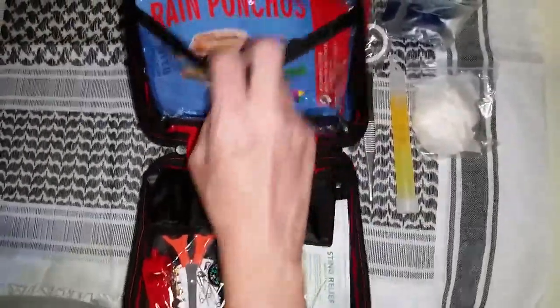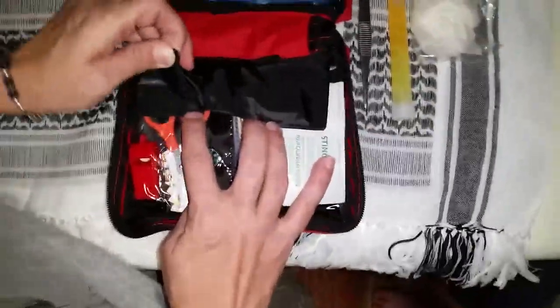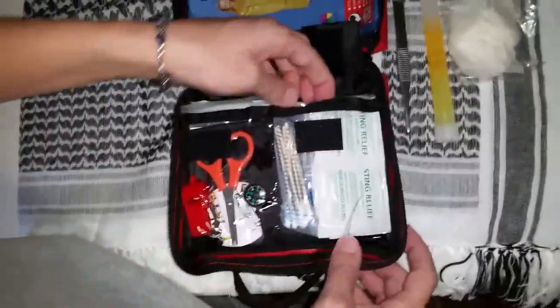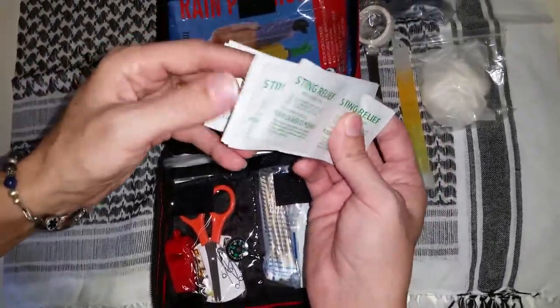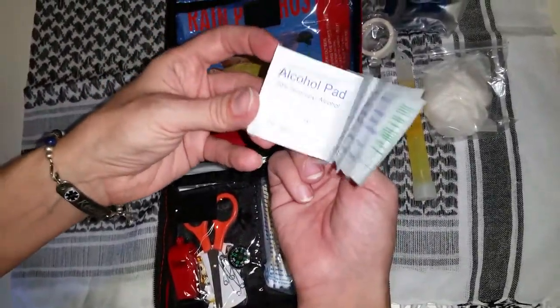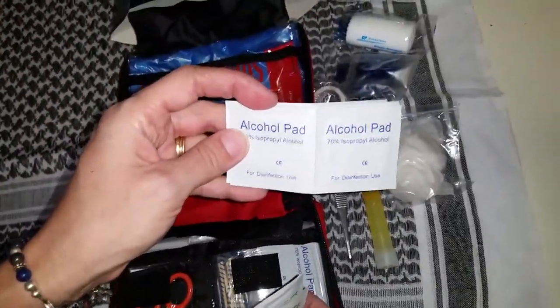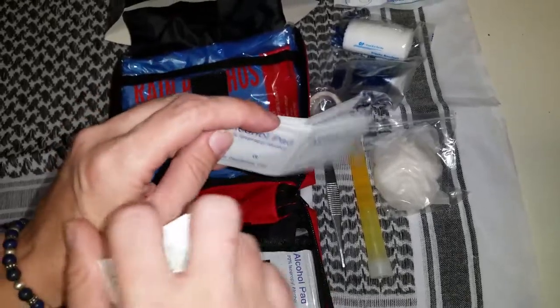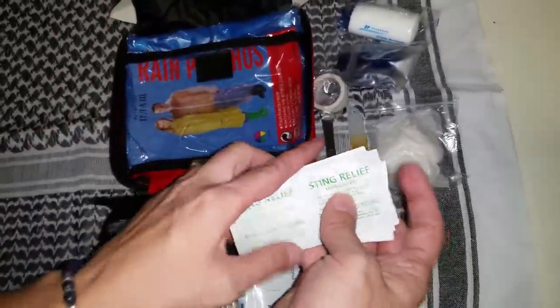Rain poncho. And your second section here — sting relief and alcohol pads. Those are handy for a ton of things too. In case you get any goopy or sticky stuff on things, those will take it right off.